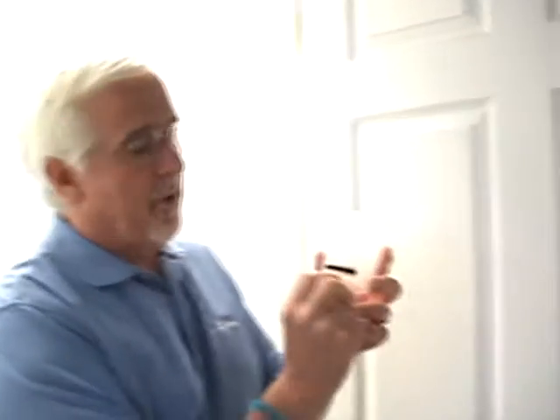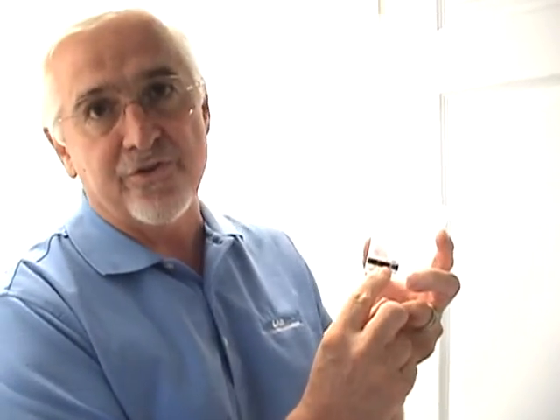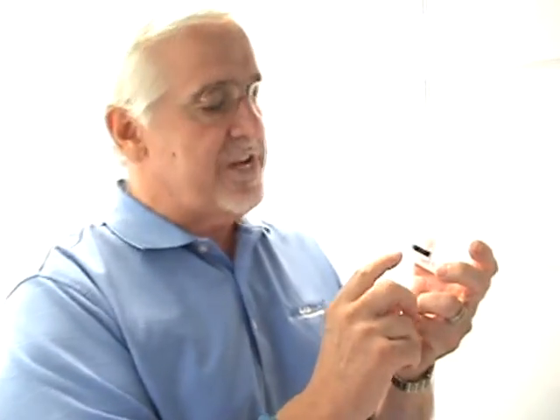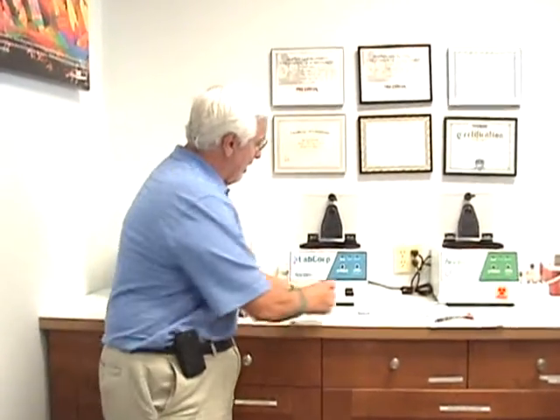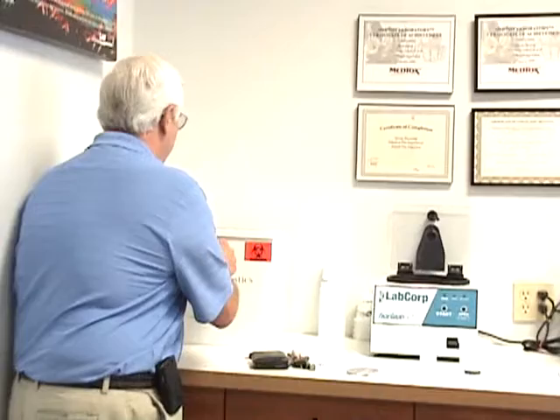Right here on this container is a temperature strip. This temperature strip is intended to let us know if the urine is at the proper temperature to have just left your body. So we're going to back that camera up, and we're going to continue right here. Again, this is particular to our store. We're going to let that sit there for a couple minutes because the rules of drug testing tell us that we should check that temperature within 4 minutes of the actual collection.